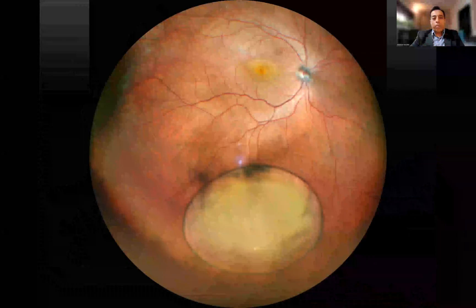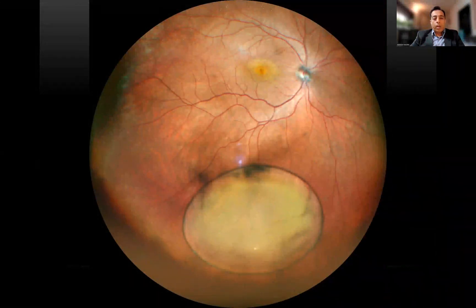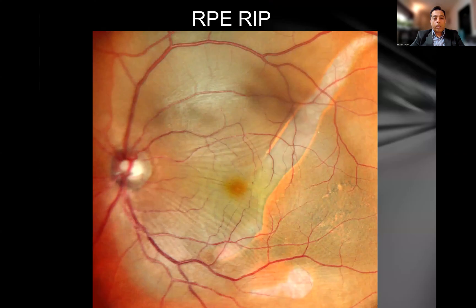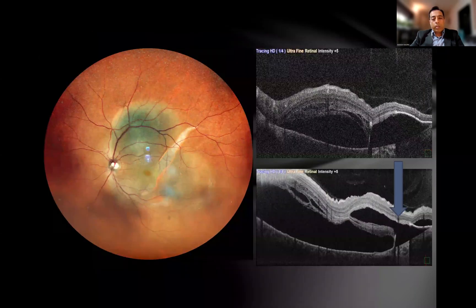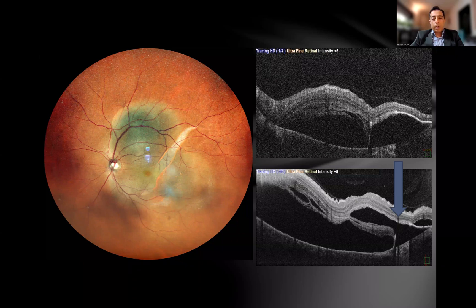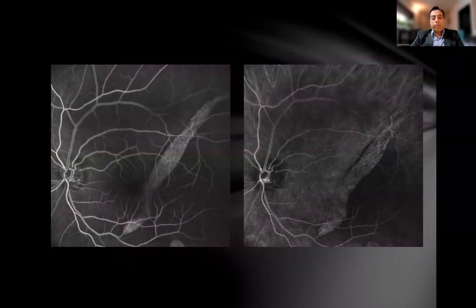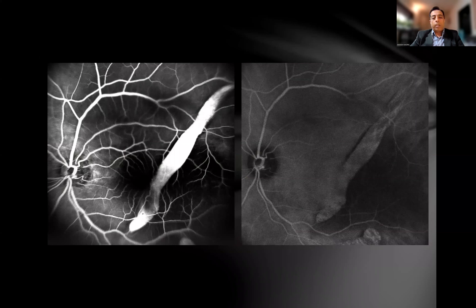This is a patient of a lens drop, and you can see the wide-field image of the lens lying at the bottom. A patient came to us with an RPE rip — he was being treated for AMD with multiple injections. You can see the area from where the rip is passing, and when you do the OCT, you can make out exactly the area where the rip is happening. The angiography confirms the whole dark area is where the RPE has ripped off, clearly demarcated.